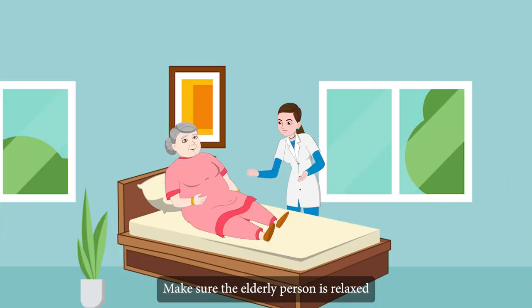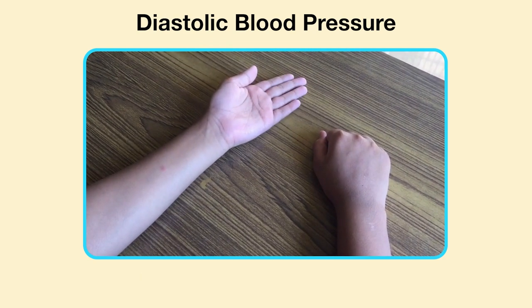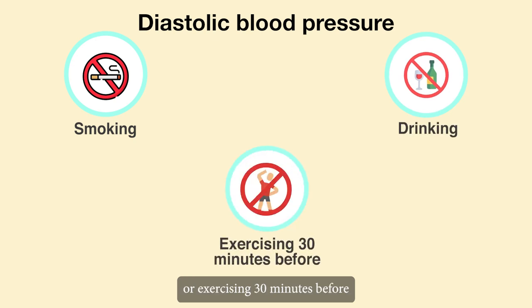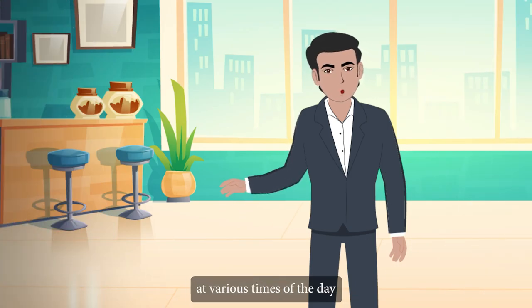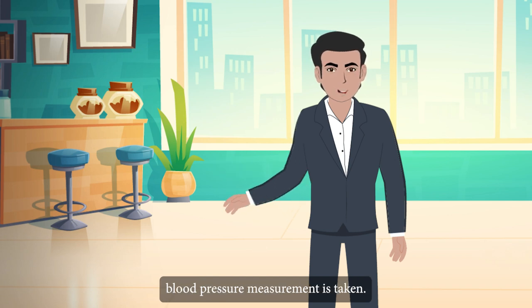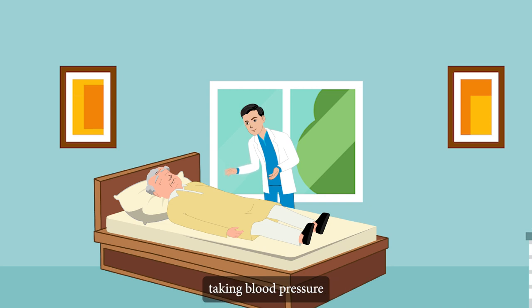How to use an automated blood pressure machine: make sure the elderly person is relaxed before taking their blood pressure. Ask them to place their arms straight, palm up, on a level surface such as a table. Avoid smoking, drinking, or exercising 30 minutes before taking blood pressure. Take elderly blood pressure at various times of the day and keep track of when each measurement is taken. Rest for 3 to 5 minutes before taking blood pressure, plus a few minutes more if the elder has recently been very active.